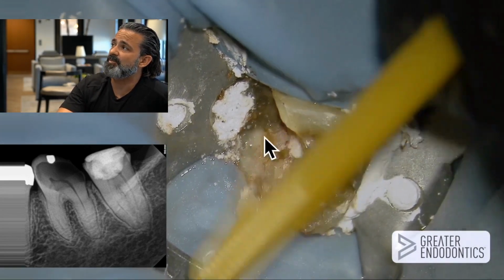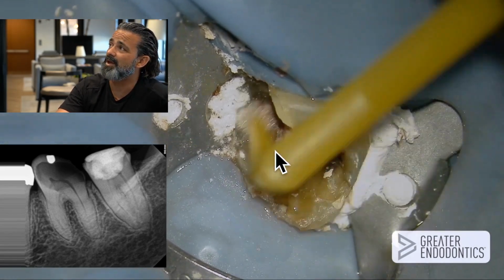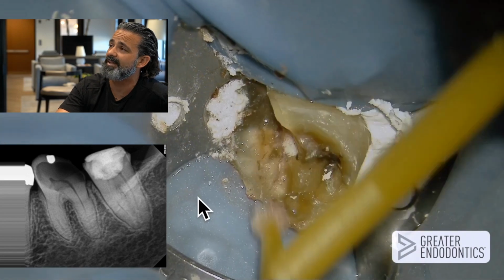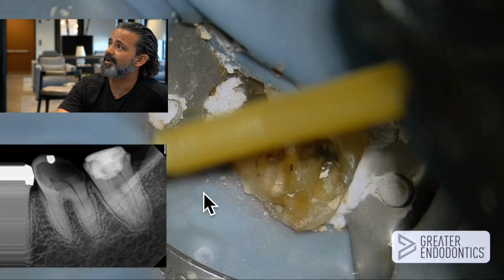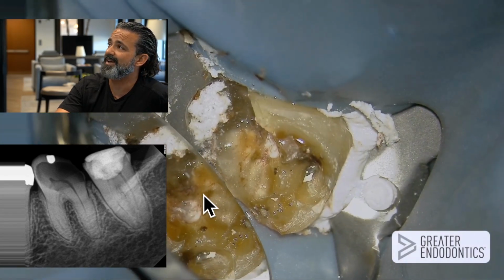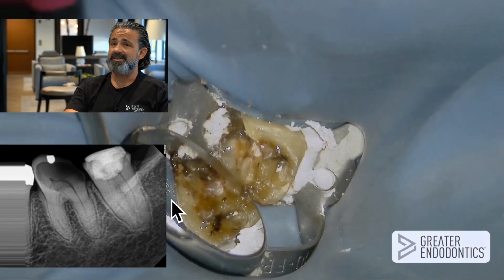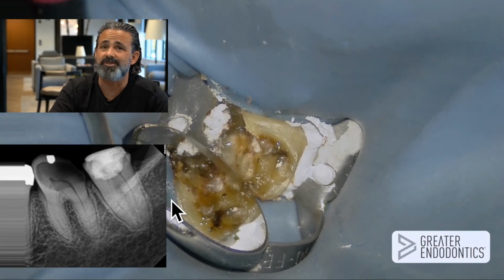So always pay attention if you like to do the X tip in the third molar space. Now I'm just taking isopropyl alcohol and I'm just burnishing that caulking in. It sat for a while. I'm hoping for a blood clot to help happen on the other underside of that in the pulp chamber, and seeing if I can actually maintain a dry environment. And if I can, I'm not going to re-access the tooth for right now. This is where I'm going to do something a little bit crazy.